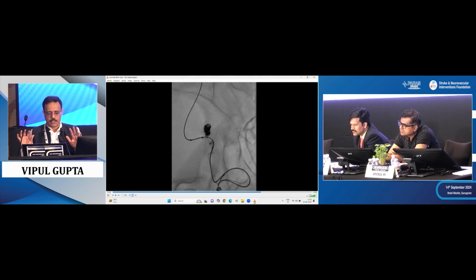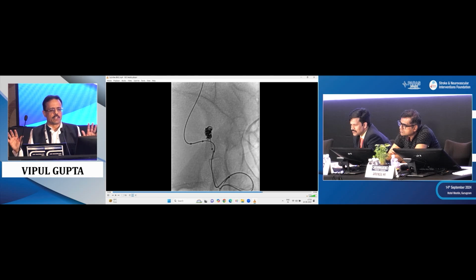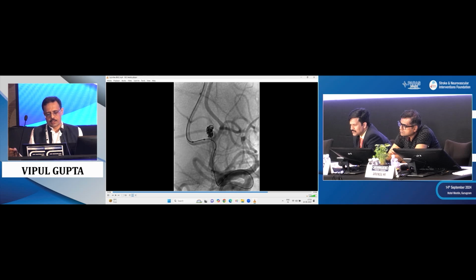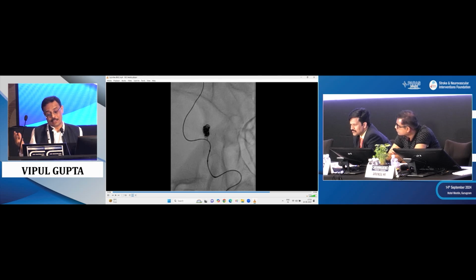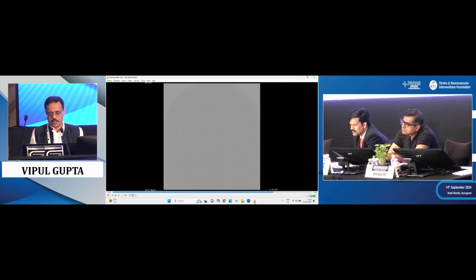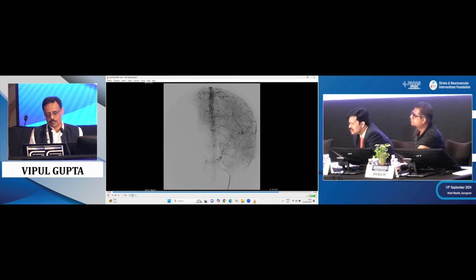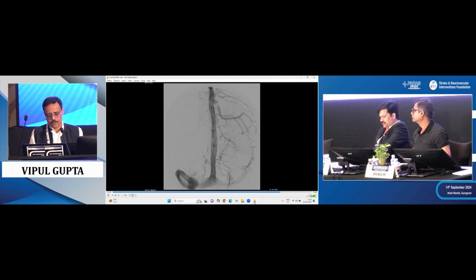I thought I can live with it because now we can safely give her aspirin or anything and get this shape in the end. So give us the best chance that there is no recurrence. Small tip remained out. I was okay, I detached it. But rather than taking out that coil, because to me, that shape was very, very important in trying to prevent a recurrence. Only follow-up will tell us how well the patient does.